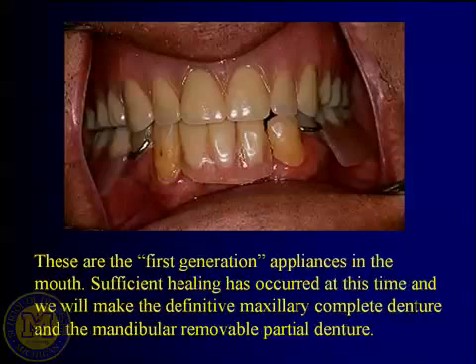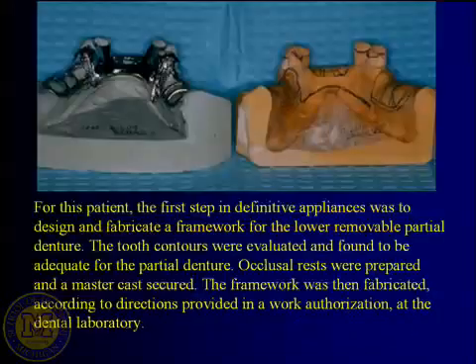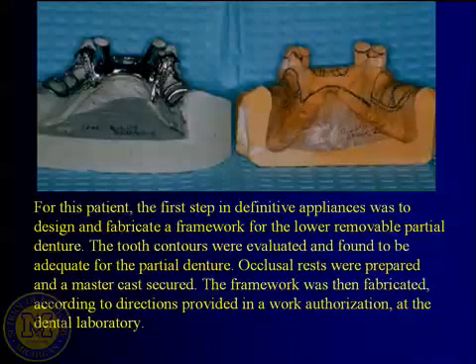So with the combination case, what do we presume? The one thing that you want to make sure you get done first is if it's an upper denture and a lower partial denture, that you want to make sure that you have your lower partial denture framework completed. Now I understand that in many cases there may be some amount of mouth preparations to do. Mouth preparations may include the making of surveyed crowns. Okay, that's not the purpose of this course. Okay, I assume you know all that from sophomore year.